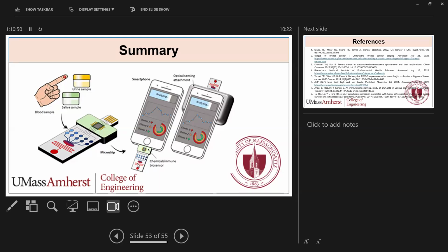If you have performed electrochemical analysis before, you would know that it's a large data set, because we want to do a rigorous validation. We cannot give any false positive or false negative results. That's the reason we are incorporating machine learning to analyze all those data sets.